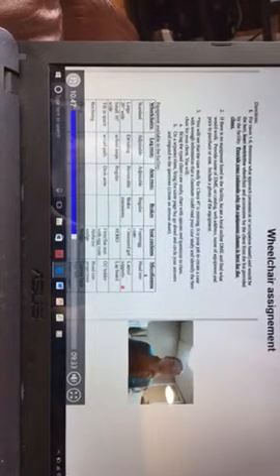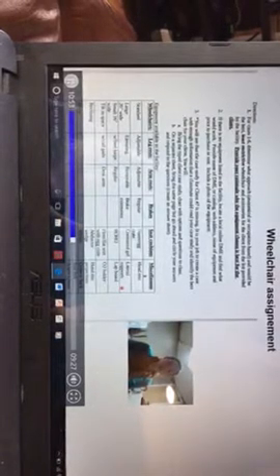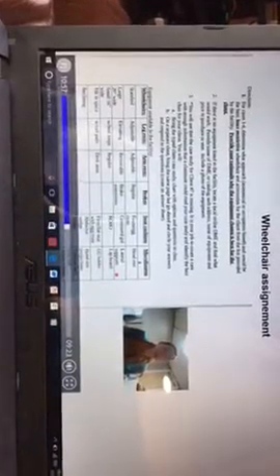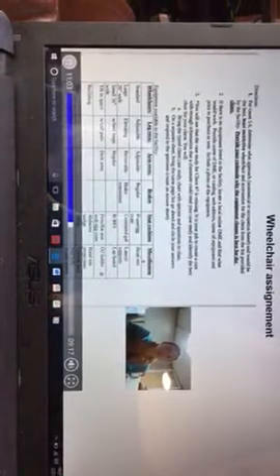If they're not going to be a long-term user of a chair of some kind, then you don't want to put lateral supports on. You want to look at what you can do to address the core weakness that they have. A lap board is a good alternative if you have somebody who keeps wanting to fall out of their chair.